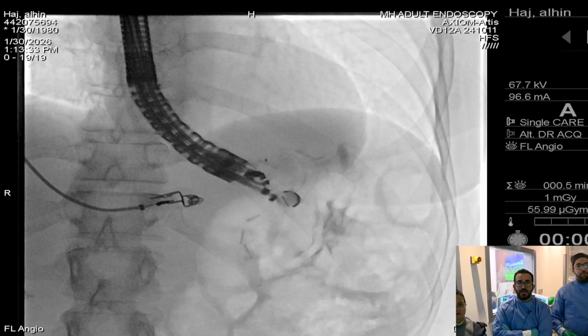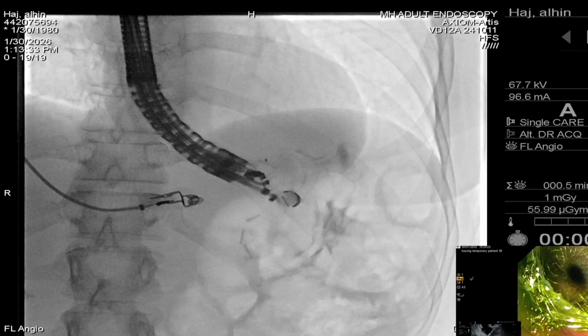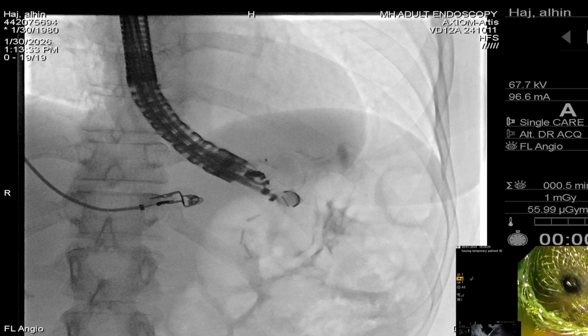And if you mean migration during performing an ERCP, it can happen, so that's why it is low risk if we do it after 2 weeks. Even if it migrates, there will be a mature tract between the two, the stomach and the excluded stomach, so we can just put another one under direct vision just to facilitate further ERCPs if still needed.